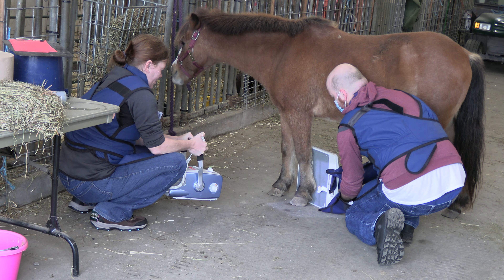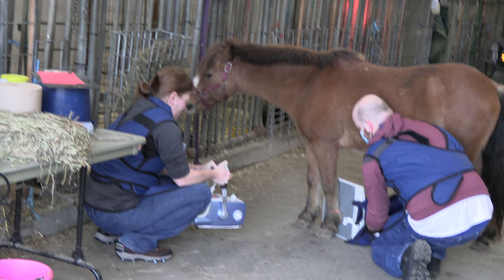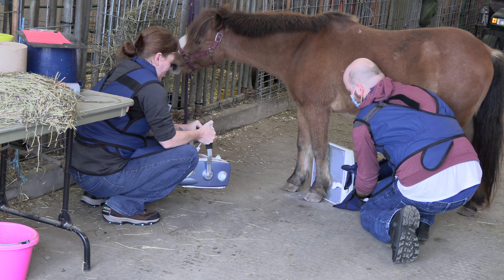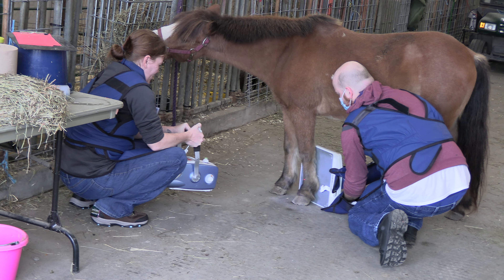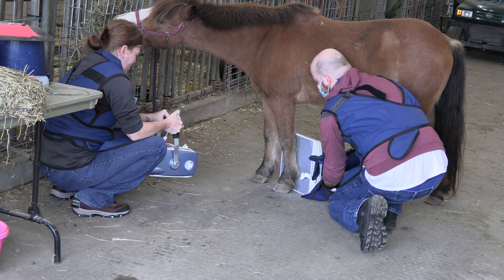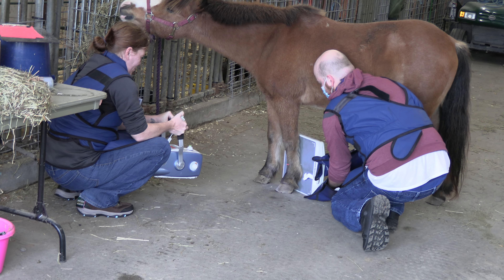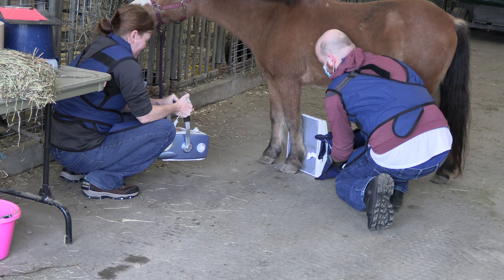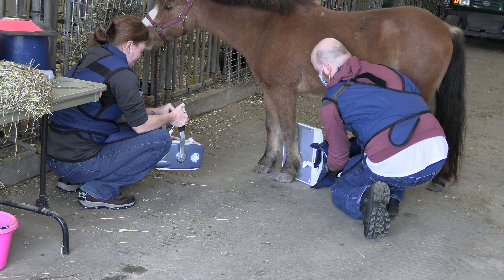And then put your crosshairs where you want them. Make sure you're not cutting out the top though. Take it as soon as you feel you have everything covered.